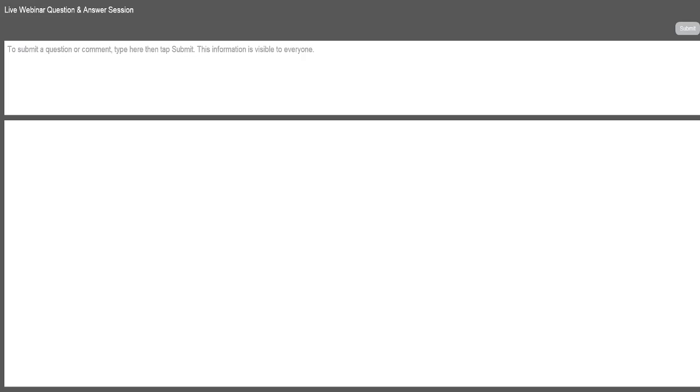A question was just asked, can AirClean be used on implants? AirClean is a product to be used on implants. It is to prevent peri-implantitis and treat peri-mucositis. Is it advisable to use on brackets and ortho? I don't see why not. Again, it's a biofilm removal. I am going to go through these in a moment. There are so many questions here.